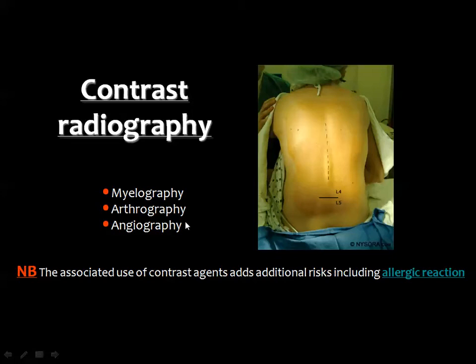These techniques were used previously very commonly in evaluation of the spine and joints, and these include myelography, arthrography, and angiography. And whenever you are using contrast material in X-rays, then you should guard against a new complication, which is the possibility of developing allergic reaction if the patient is allergic.